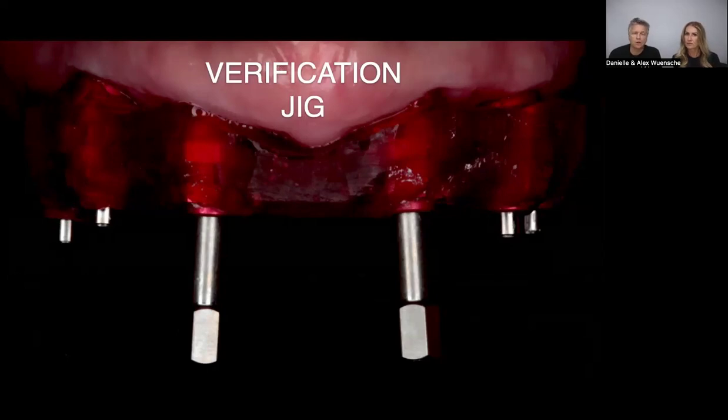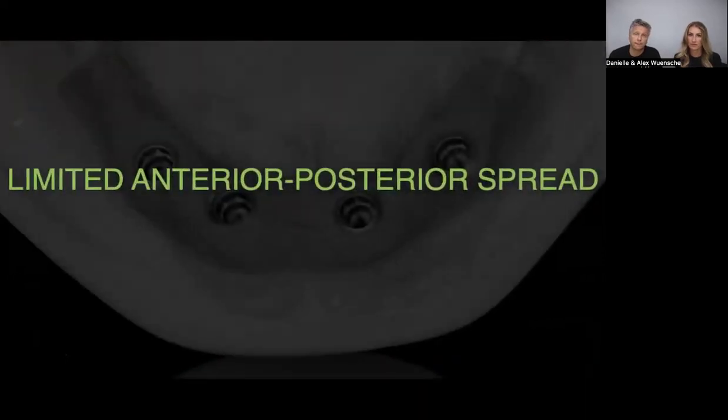Basically, it's a step we can combine with multiple try-ins or whatsoever. We don't have this as a standalone appointment, but definitely a verification check is a must for full arch. Even for 2-3 unit bridges, we always do verification checks. 100%, because we find also sometimes we do need to do a secondary impression if you have to cut the verification jig. Right.